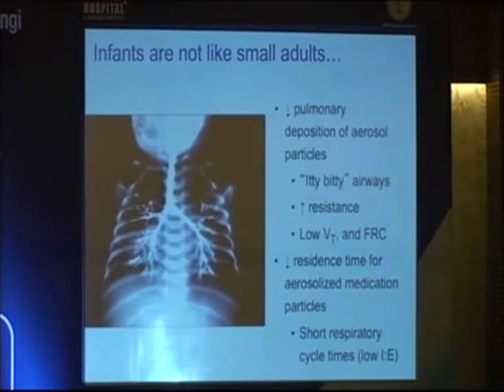But also because you have such a rapid respiratory rate and small inspiratory time, that doesn't allow enough residence time for those aerosol particles to remain in suspension to go down into the lower airway. So you run the risk of not getting a lot of drug, if not any.